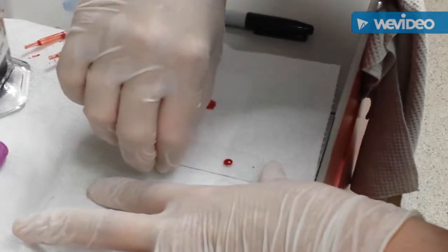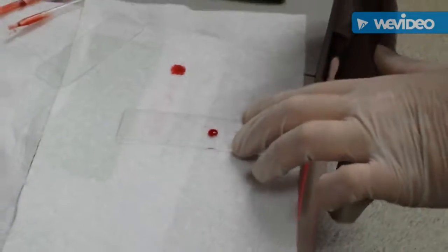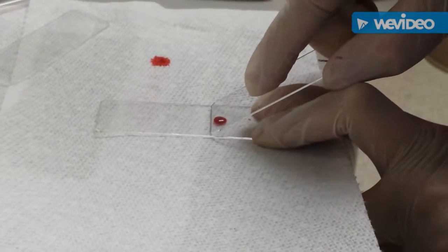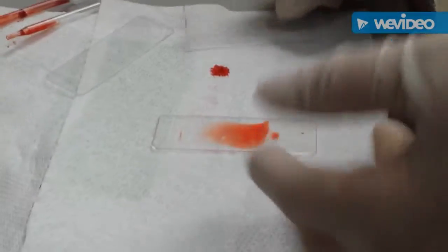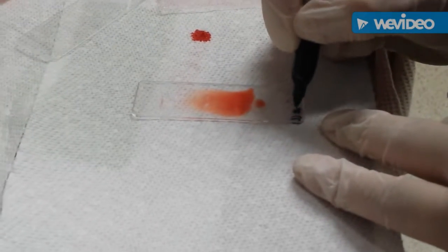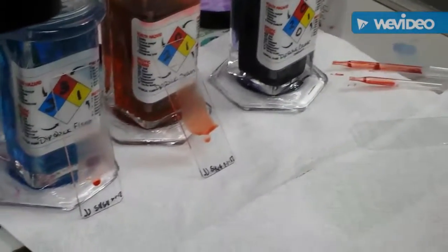Okay, then we are going to take a clean slide here, and we are going to place our fingers on the end. We are going to gently pull this back, allowing the blood to work its way all the way across, and then slide it forward. And then we're going to label that with JJ's information and today's date. And then we're going to place this one butt down up here as well so that they can dry. And once they are dried, we'll be back to go ahead and get them stained.